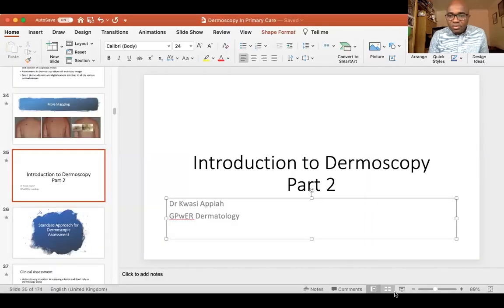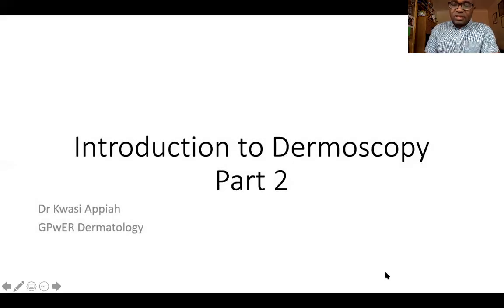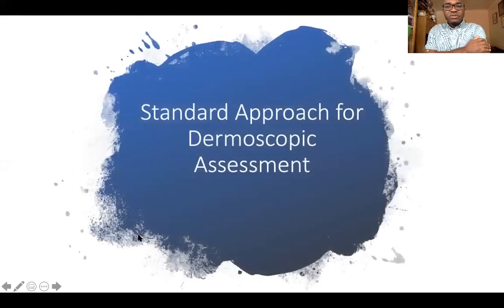Okay, so this is a follow-on from the first part, our first YouTube video, which was the basic introduction and overview of dermoscopy and some basic principles. In part two, we're going to concentrate on a standard approach to looking at dermoscopic lesions in practice.